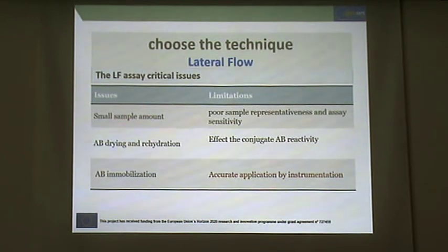And then the construction, the preparation of the device requires a very accurate application by instrumentation, which is very expensive, a high investment equipment. Generally, it's a process that we can externalize to professional companies.